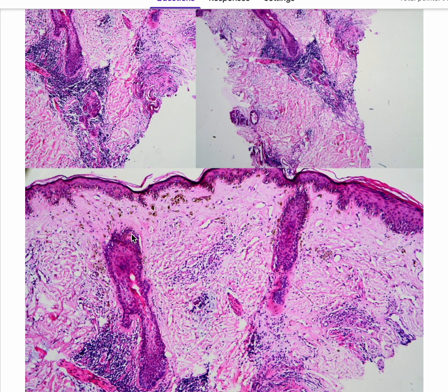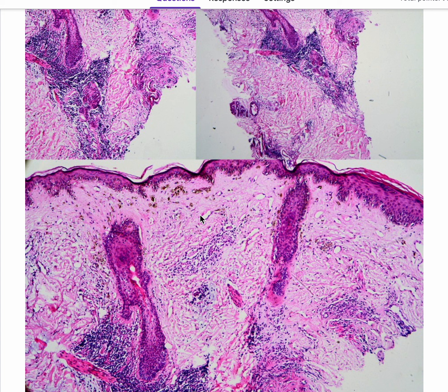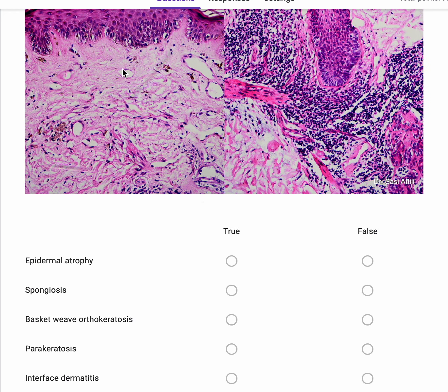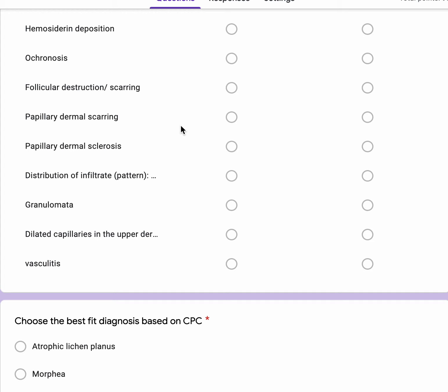If you look back at the lichen sclerosus cases I posted earlier, it can be a bit tricky, but if you look at cases repeatedly, in lichen sclerosus as well you see all the changes that you're seeing here, but you don't usually see the deep infiltrate. You see the dilated capillary loops, which are present in lichen sclerosus. But often at this phase, what you do see is a band-like lymphocytic infiltrate underpinning the sclerosis when it is present. Here it is more papillary dermal scarring, post-inflammatory, in an interface dermatitis that is often seen. But it is a difficult case. You can see here, this is not papillary dermal sclerosis. This is just scarring that is present here. You can make this out in this higher power picture.